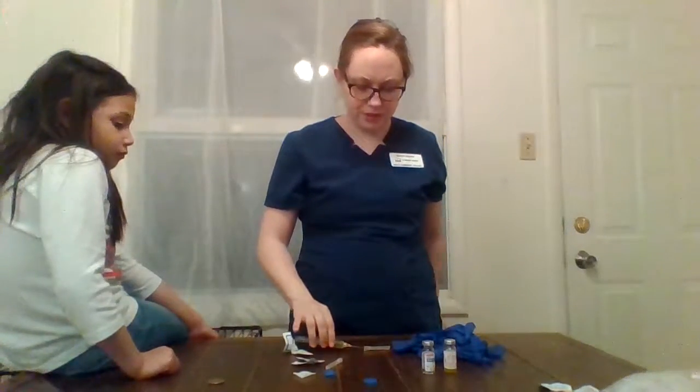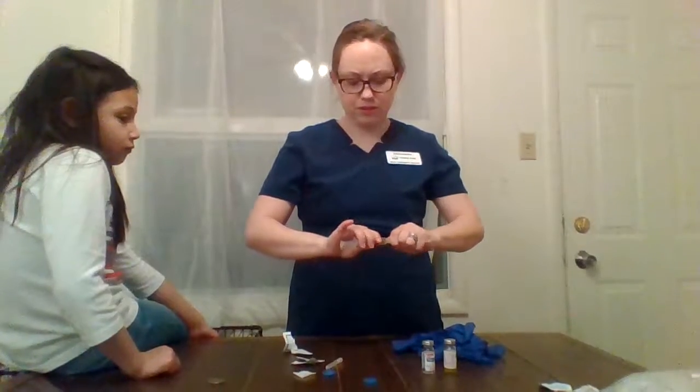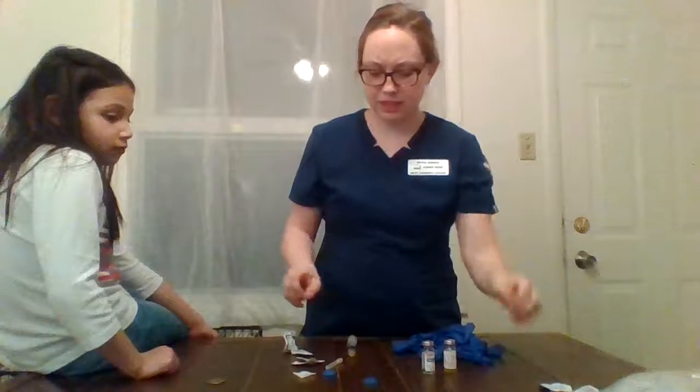Going to recap, single-handed technique. Dispose of that in the sharps container.